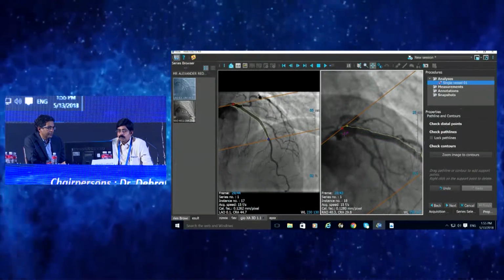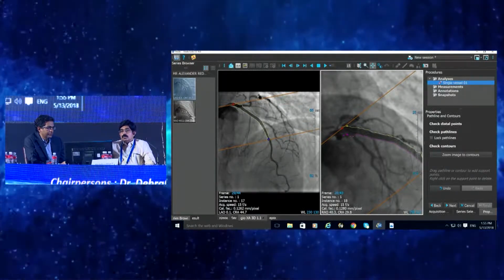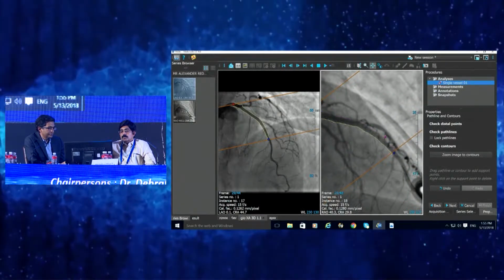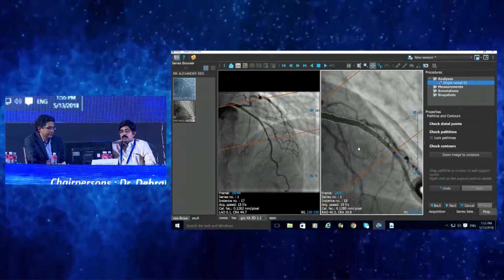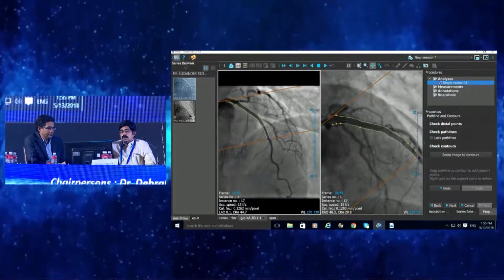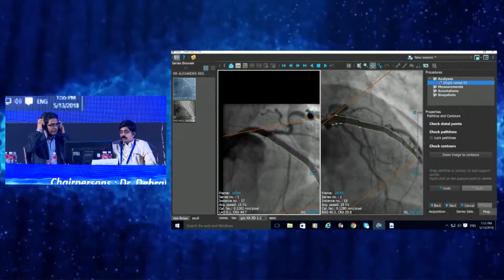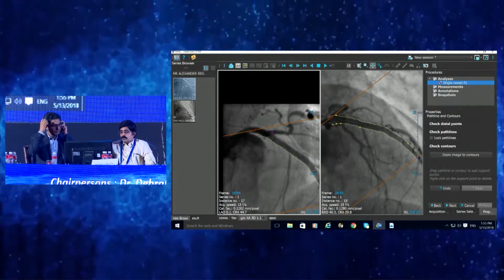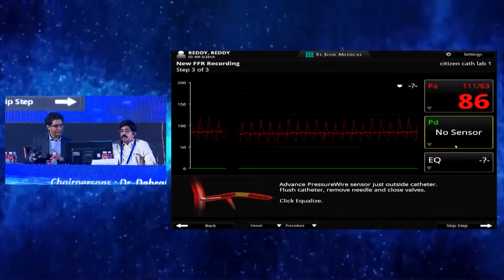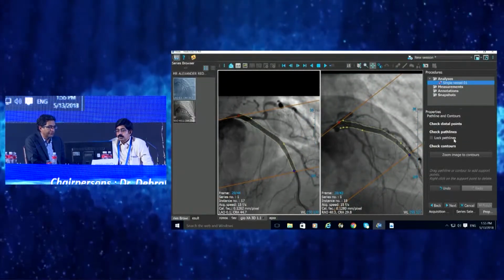That's okay. Just another minute, I think it will come. Sure. She's adjusting the contours again. Right. We have to check and just adjust the contours minimally, and that's okay, Lakshmi. That's fine. She doesn't budge whatever you tell. Oh, she has to do it right. Okay. Show the same screen for a minute more. Sure, we're going to stay with you for a minute until we are done with this QFR.